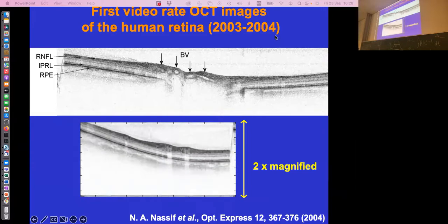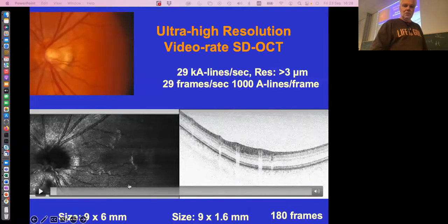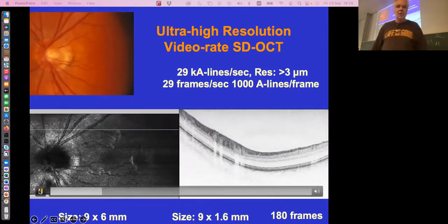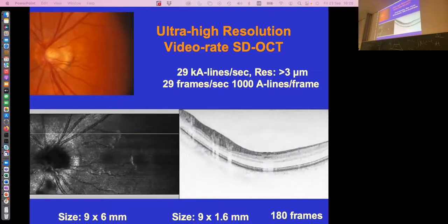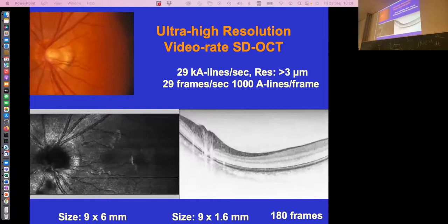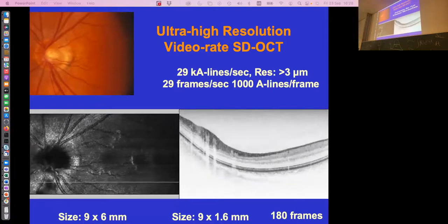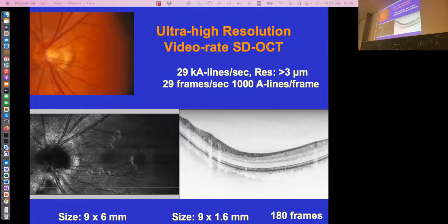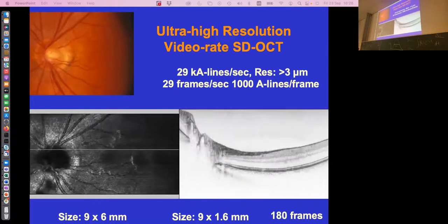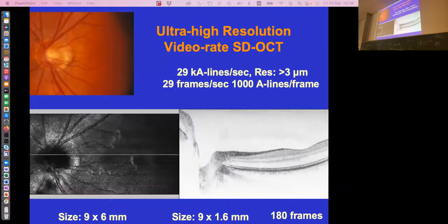Let me see if that's next. Okay, is this running the movie? This shows you the optic nerve head and the fovea. The fovea is this area here that has the highest density of photoreceptors. It's the only area with which you recognize characters or faces or watch TV. When you see this layer dip down, the photoreceptors are right here. So you want to have the photoreceptors next to the exposed light.